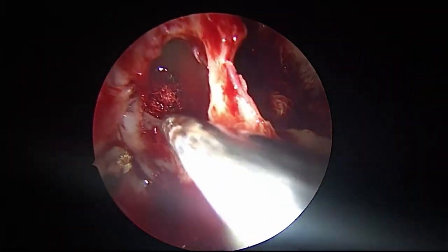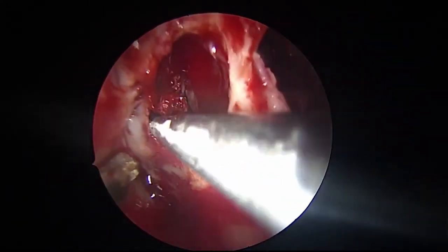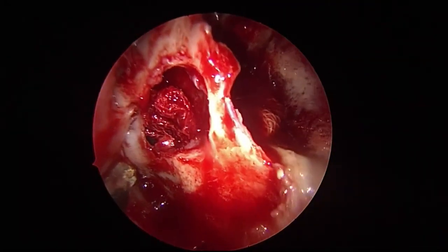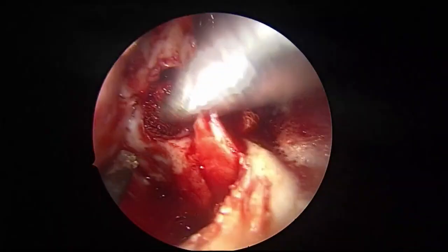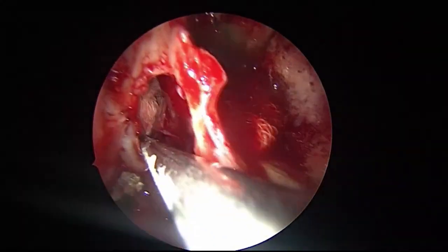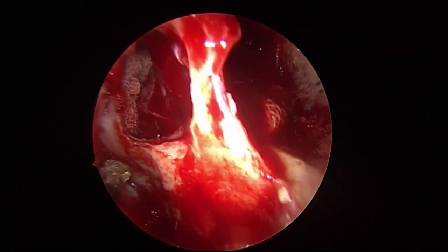See, this is the maxillary sinus lumen. See the secretions. This lumen is pushed laterally by the tumor. Okay? Once I remove the gauze, you will be able to see better.